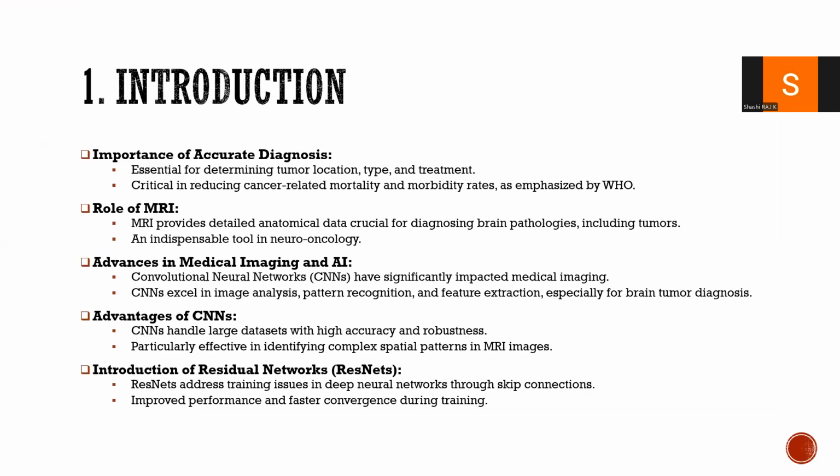Introduction. In this research work, deep learning techniques with the ResNet18 architecture and focal loss were used to investigate brain tumor categorization in neuro-oncology, with a particular focus on MRI scan images. Loss curves with the expected L-curve pattern show that the model exhibits promising convergence during training. The model effectively distinguished between tumor and non-tumor classes.